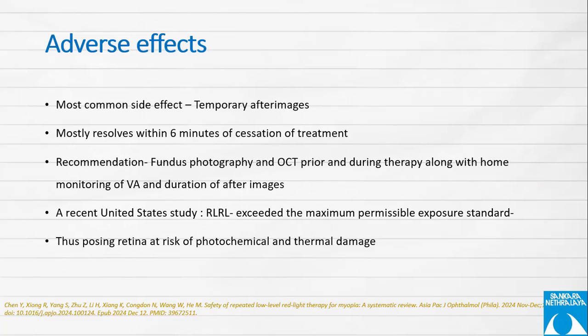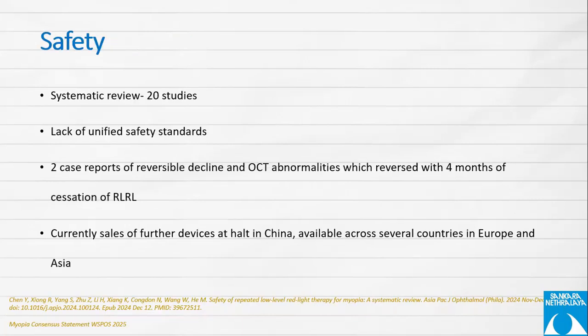The recommendation from their side is to do fundus photography and OCT prior to and during the therapy, along with home monitoring of visual acuity, and to also document the duration of after images. Recent United States studies also suggested that red light therapy exceeded the maximum permissible ANSI standard of light exposure, and it can pose a risk to the retina of photochemical and thermal damage. At present, the sales of further devices are on halt in China, but available across several countries in Europe and Asia. Safety is still a concern.